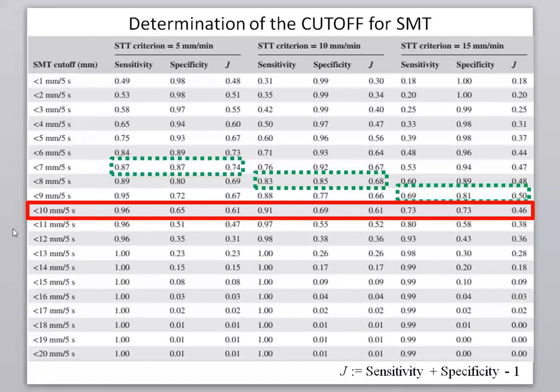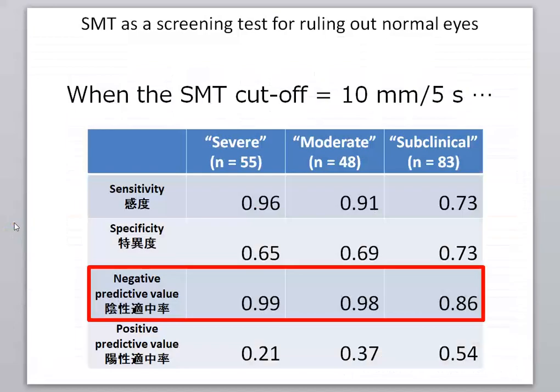This is a bit difficult, of course, with many different opinions, but if we take into account the original concept of strip meniscometry methodology, I would like to suggest that 10 millimeter could be the best cutoff length for the actual situation in clinical practice.